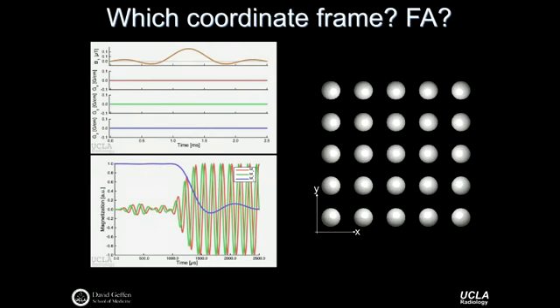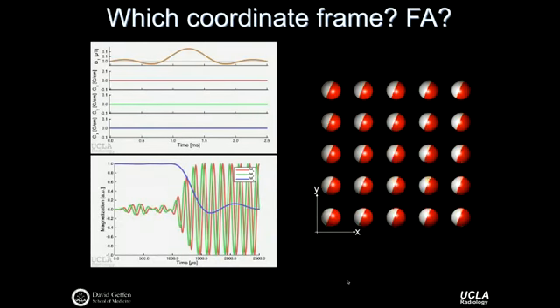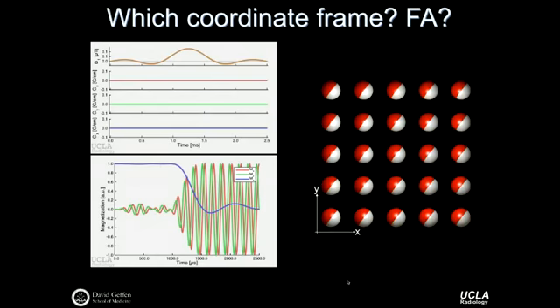My magnetization starts in this state. I hit it with an RF pulse. Hopefully, there it goes. So you see it wobbling around, and then the RF pulse really takes over and tips it down. What's the flip angle? 90. Just 90. Yep.